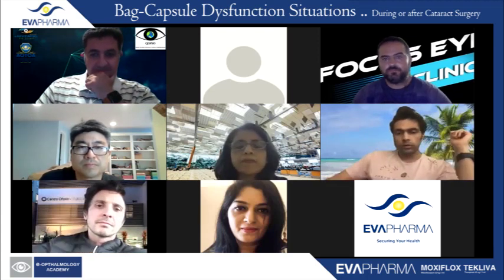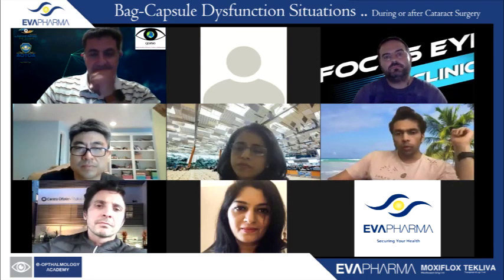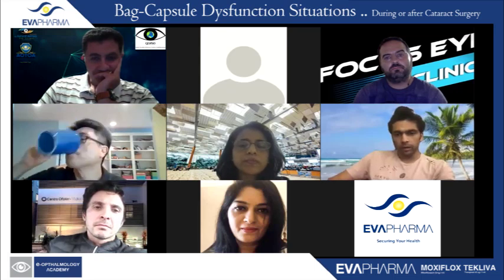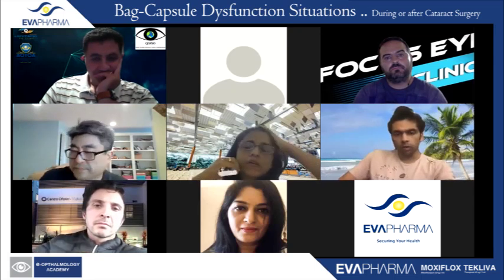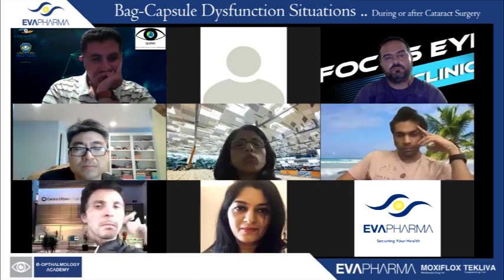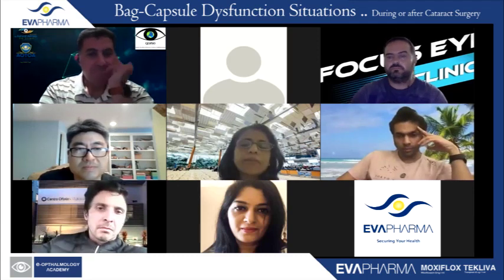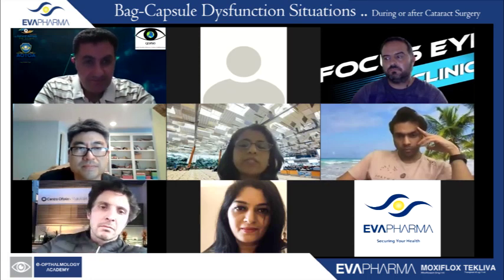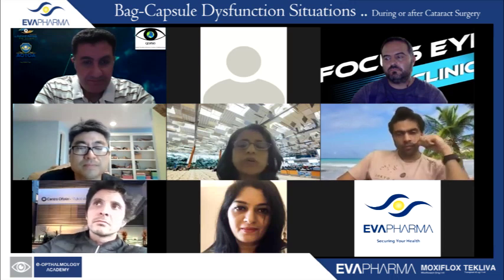Susan, there's a question. Where can you not use this particular technique? Let's say you still have the bag, but when do you not use this? I would probably not use it when you don't have a good capsular bag in place at all. When you've already entered the vitreous cavity, a posterior capsular rent, for instance, and the vitreous has already been entered, you're going to be doing a vitrectomy anyway. There's really no point in trying to save that bag.